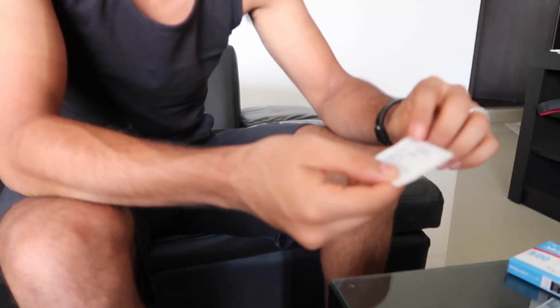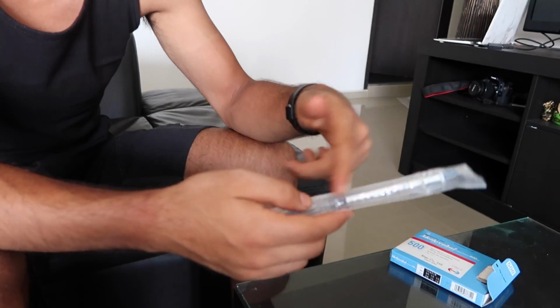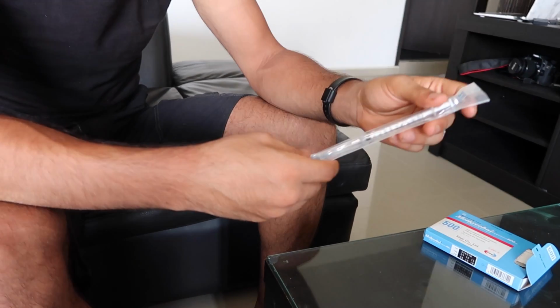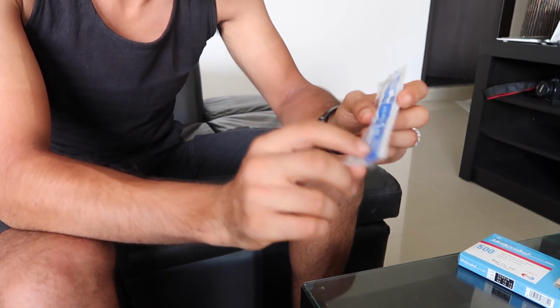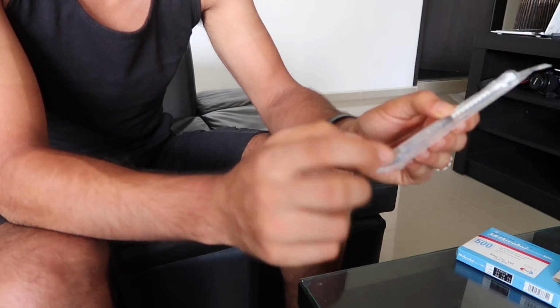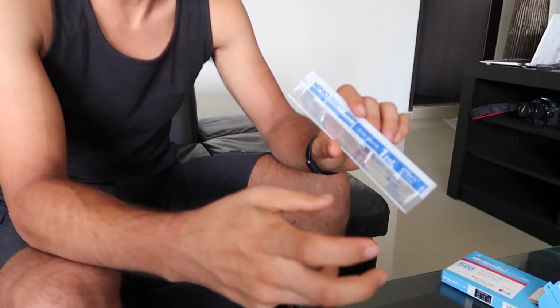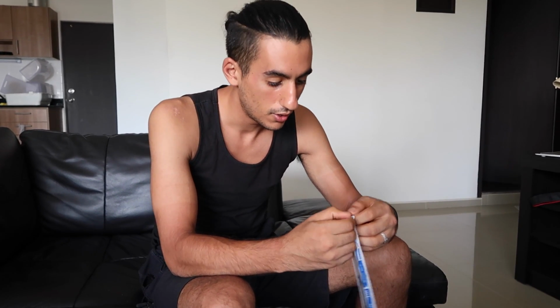Now, the other things you will need are an alcohol wipe, which is an antiseptic wipe, and a needle. We have these insulin ones. They are 27 G, which is the thinness of the needle. The higher the number, the thinner it is, and the less you'll feel it. The lower, the bigger the needle is, the more you'll feel it, but also the quicker you inject it. There's no real rush to inject it quickly, so we just went for the 27s. A lot of people use 29s, both are very good. Anyway, let's get going.